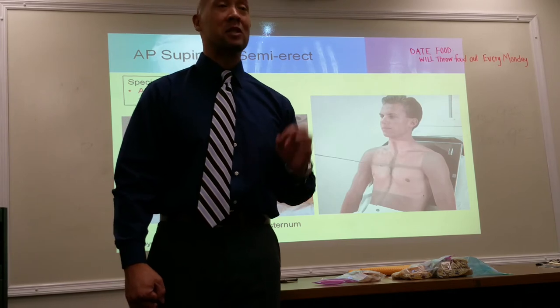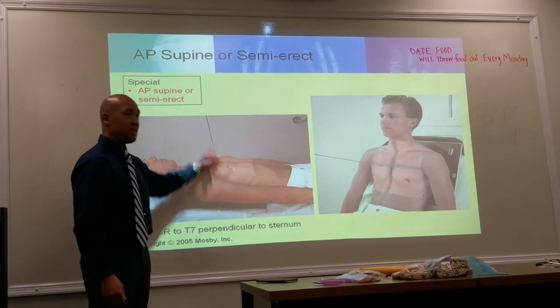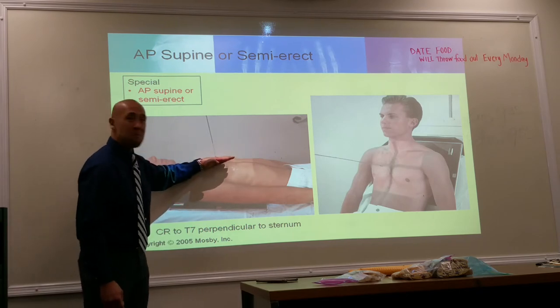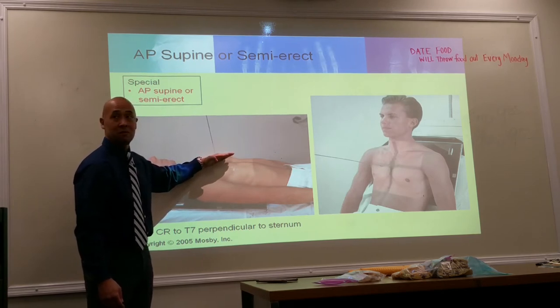Not the image receptor, it's perpendicular to the sternum. And that's why, Nick, you noticed, he said, well, how come it's axial? Well, it's because it's matching the angle of the sternum. The sternum is going up like this. It's perpendicular to the sternum.